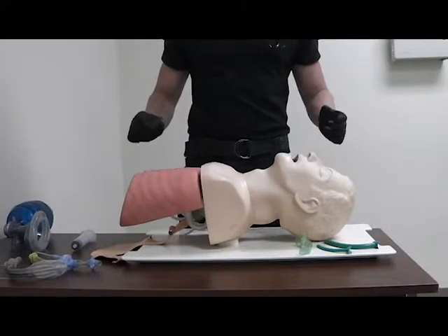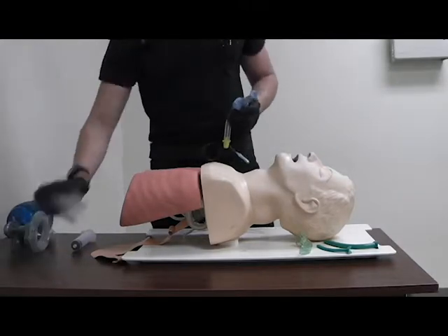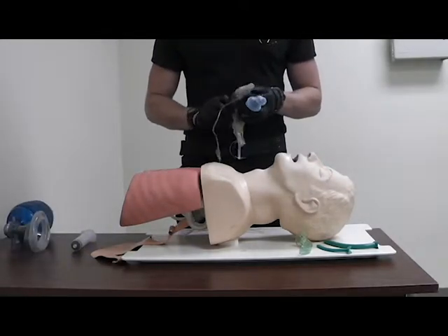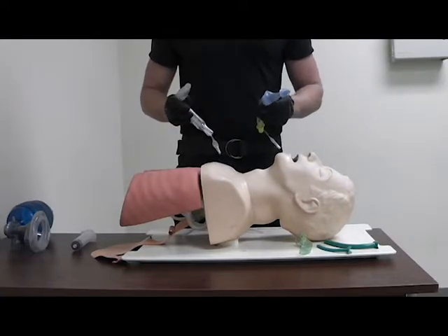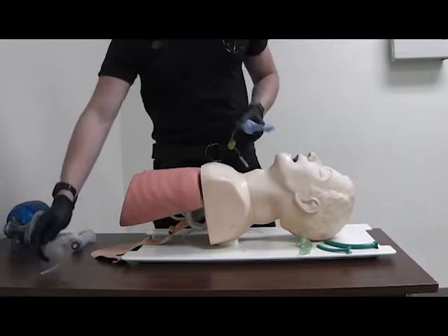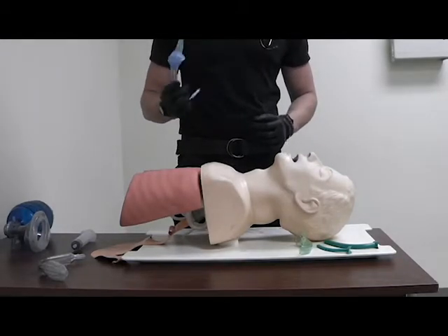Supraglottic airway demonstration. Your supraglottic airways are the KING and the LMA. Since the procedures are exactly the same, I'm only going to be demonstrating on the KING. The KING sizing is designated by height, whereas the LMA is designated by weight.